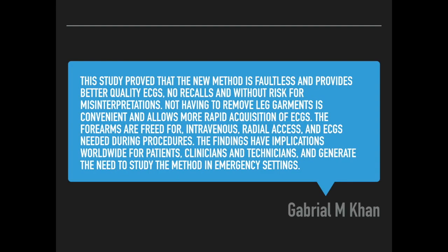Now, there is good data and good evidence for using this lead placement method. Kahn et al. found that the new method is faultless and provides better quality ECGs, no recalls, and without risk for misinterpretation. You don't have to worry about removing the leg garment, and the forearms are free for IV access. This is a good method. It's validated, and I think that it is a method that we should adopt across the board and standardize for obtaining 12 leads at Jessamine County.